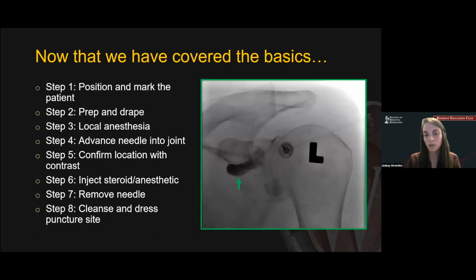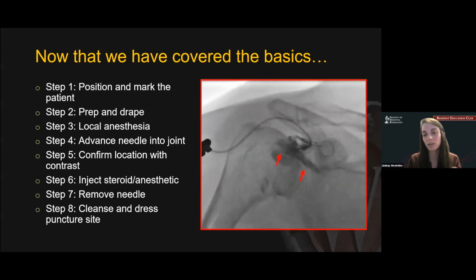So all of those are very normal. And again, the contrast isn't pulling at your needle tip, it's flowing away freely, nice and low resistance. So in contrast to this, I want to show you something that's more capsular, or not intra-articular.